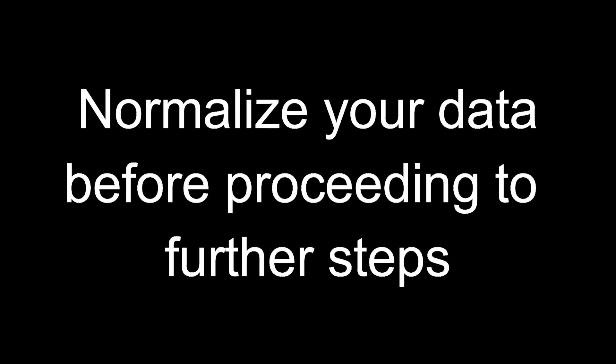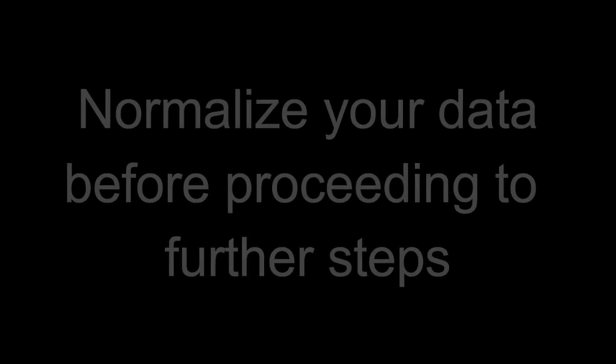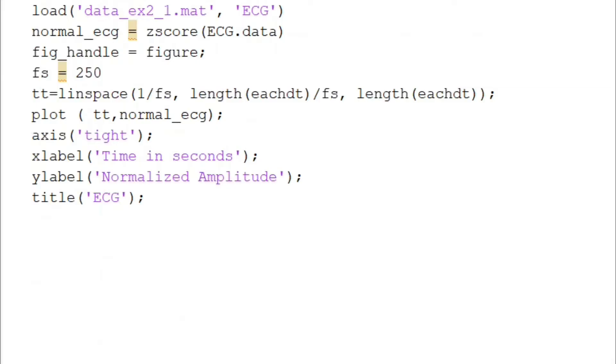Now let's begin the tutorial by first normalizing the ECG data that we have and then proceeding to the extraction of the PQRST curve. So let's move over here.